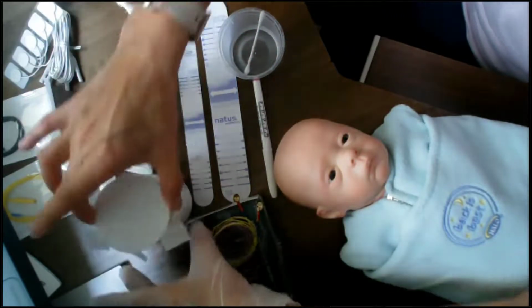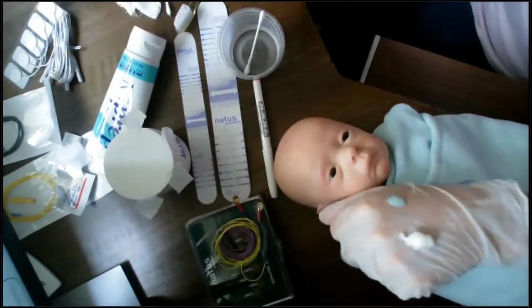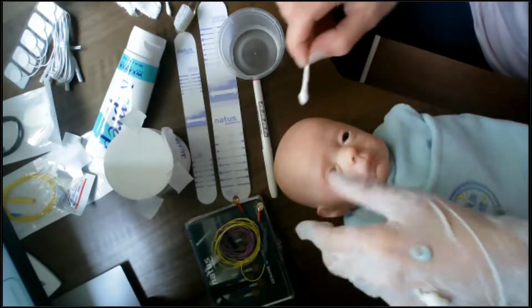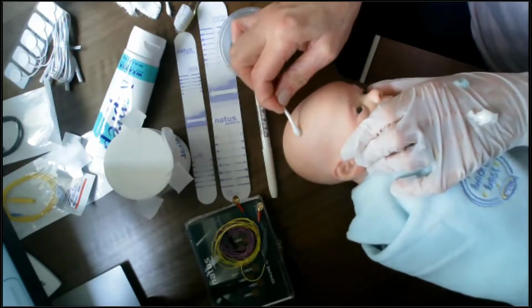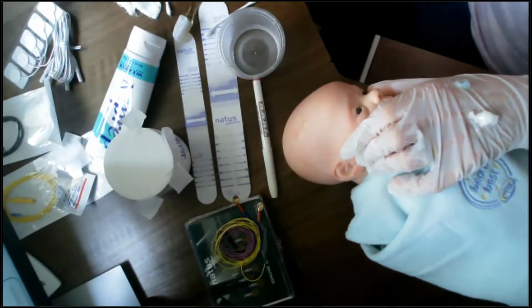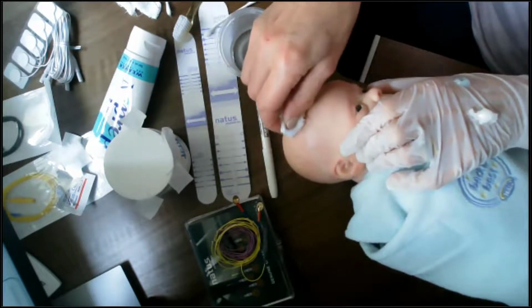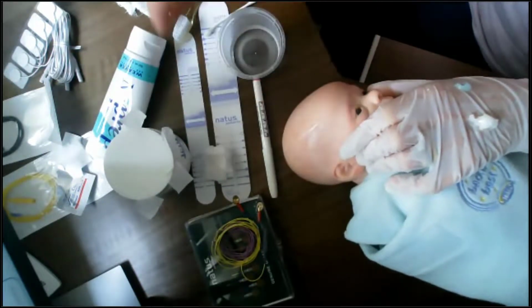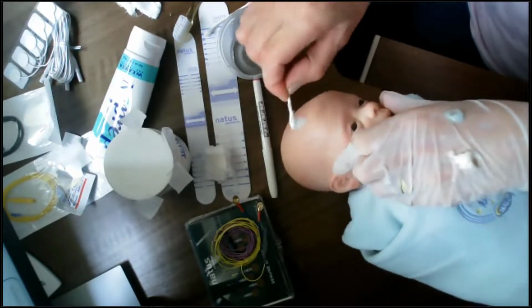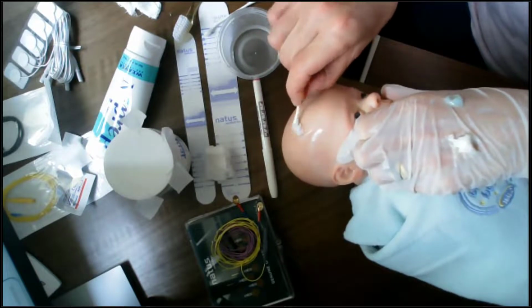I'll just put my lid back on to make sure that it's nice and clean. Okay, so what we're going to do, we're going to take the Nuprep on the cotton tip. We're going to clean, remember, backwards, forwards, backwards, forwards. We're going to take a piece of gauze in some water and wipe that Nuprep off the site. Then I'm going to take a small piece of my 10-20 paste. I'm going to put it in that place because that's the place I've just cleaned.